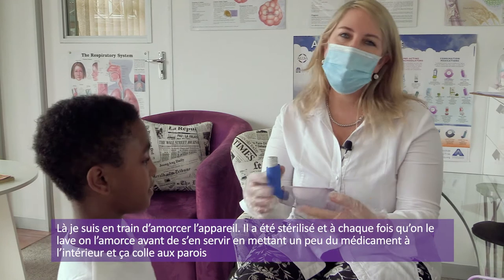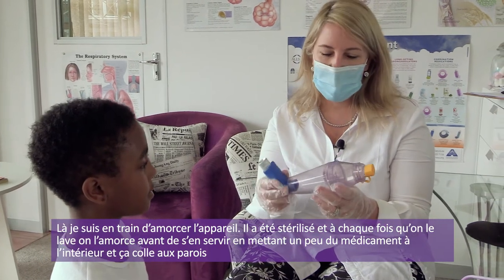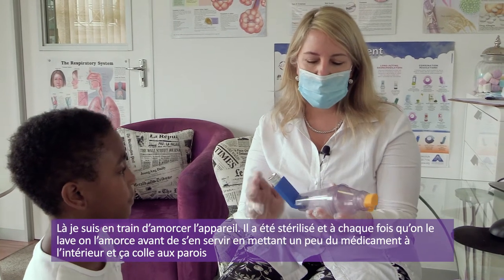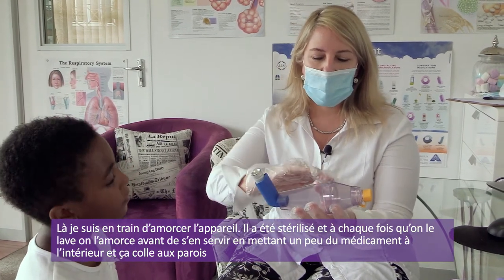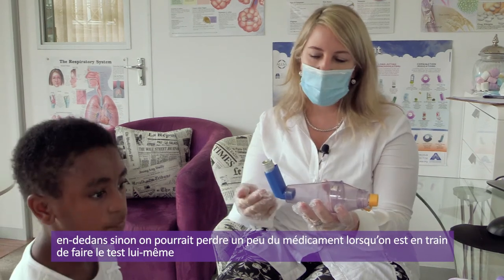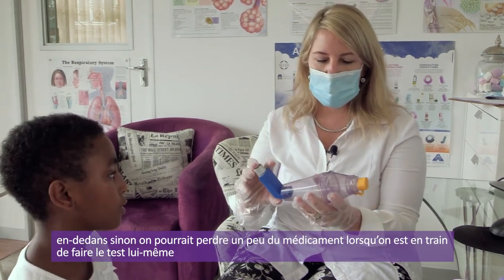1, 2, 3, 4. Okay, so what I'm doing here is I'm priming this device. It's been sterilized, and every time we wash it, we prime it first so that you put a little bit of medication in and it sticks to the inside walls. Otherwise, some of the medication may be lost when you're doing the actual test itself.